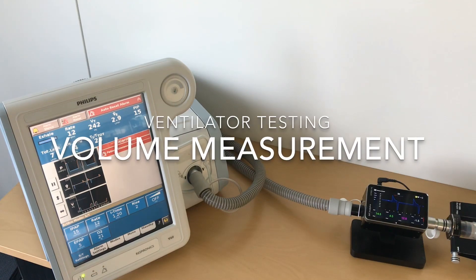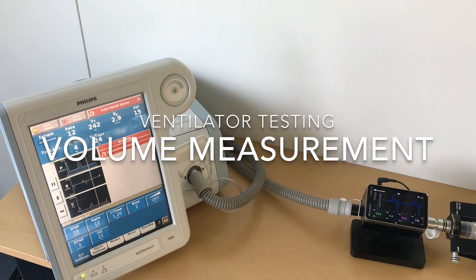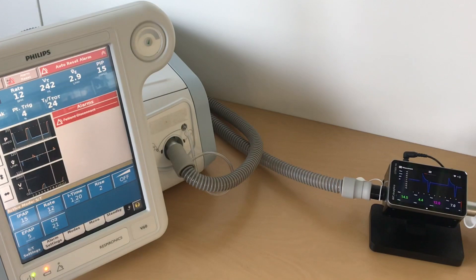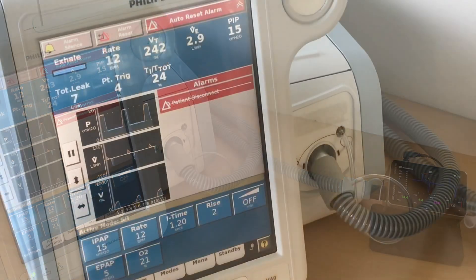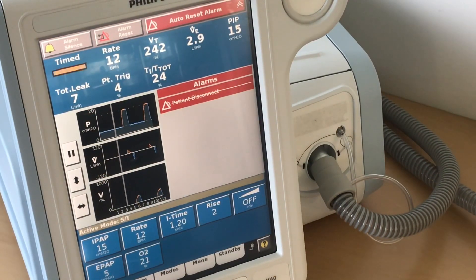In this video I show you how to do a volume measurement with a ventilator which has an intended leak. In this case it's a Philips V60 ventilator for spontaneous breathing patients.